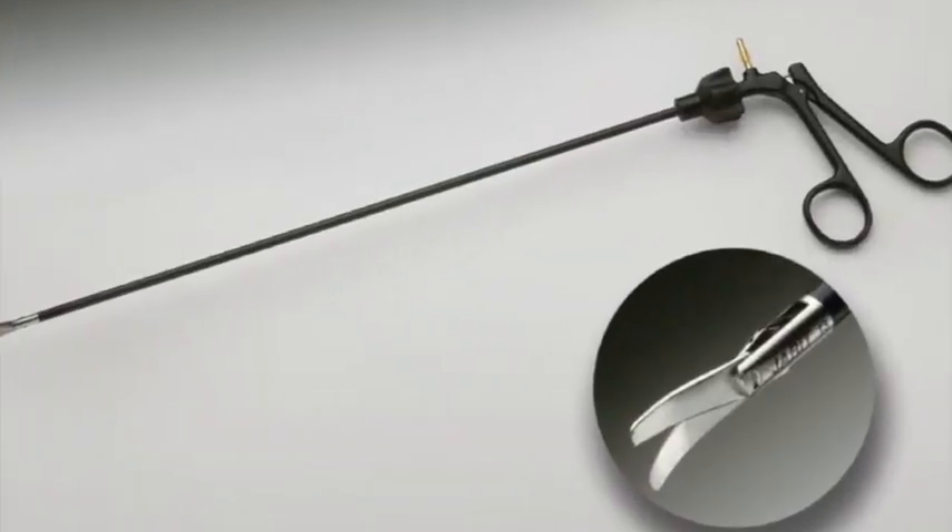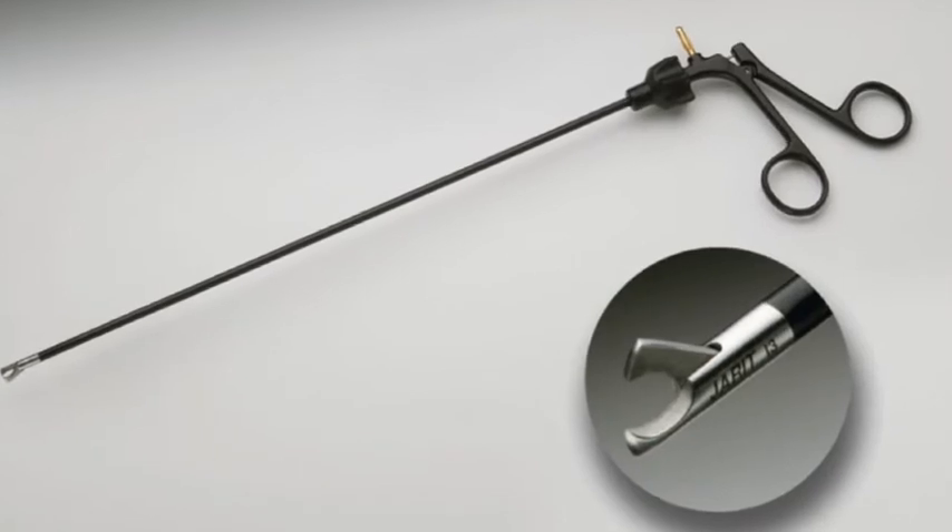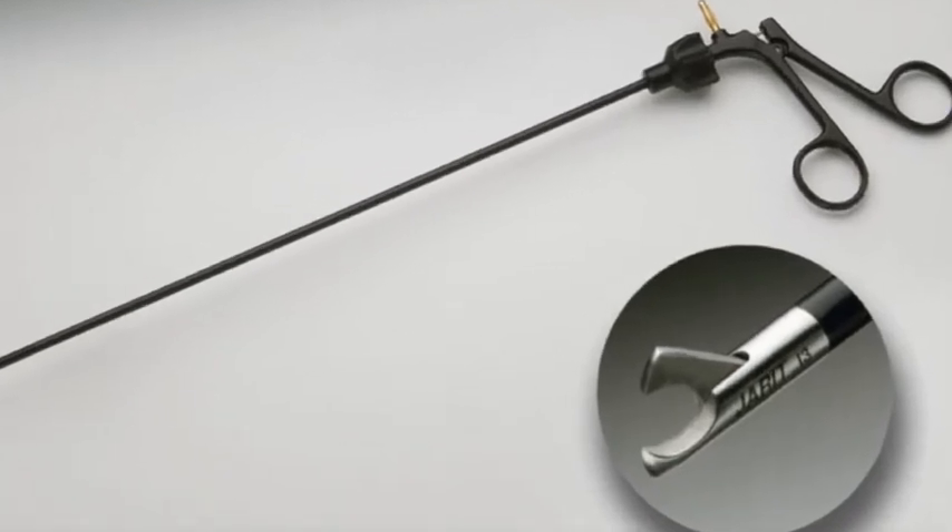We have regular endoscopic scissors used for cutting and dissecting. We also have endoscopic hook scissors — you'll be able to tell by the ends of the instrument. Surgeon's preference determines which they use based on what they're doing, and you'll learn that once you get into cases with those particular surgeons.